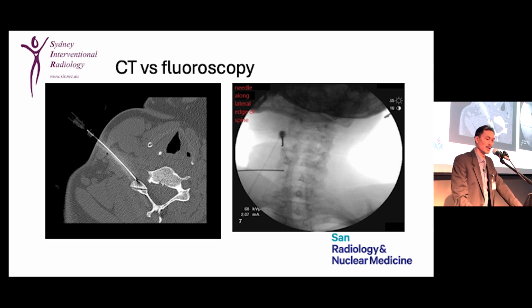I'd be particularly careful about doing injections under sort of X-ray fluoroscopy, especially given the high availability of CT and the significantly improved resolution and the safety margin. So I know exactly where my needle tip is located to the millimeter and its relationship to critical structures.